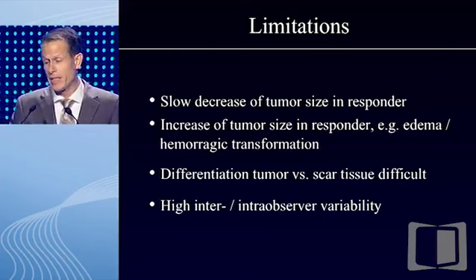And what's very funny is that even in responders, the tumor may increase in size because under therapy there might be edema or hemorrhage developing, so it might be puzzling really to tell the tumor is getting bigger, but it's still a responder. Then the next point, can we really well differentiate between vital rest tumor and scar tissue? And the answer clearly is not. So morphology is pretty tough in this regard.